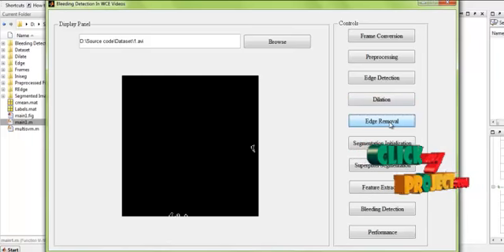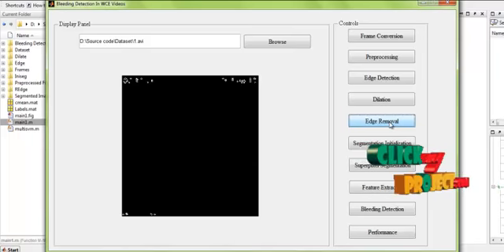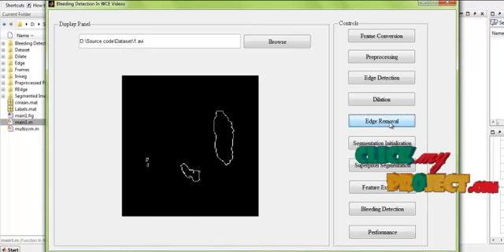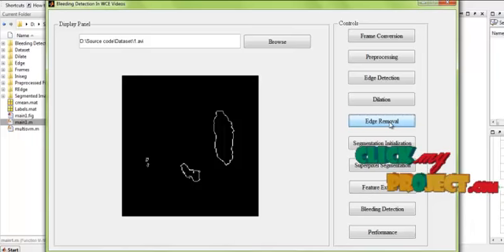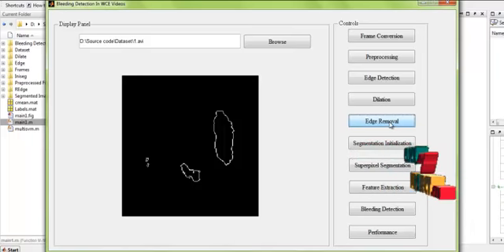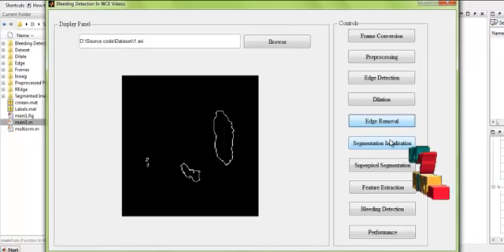In the edge removal process, the input frames were combined with the detected edge regions in order to identify the final edge pixels that are recognized in the images. These final edge pixels consist of all of the necessary edge regions that are to be used for the further initialization and the superpixel segmentation processes.